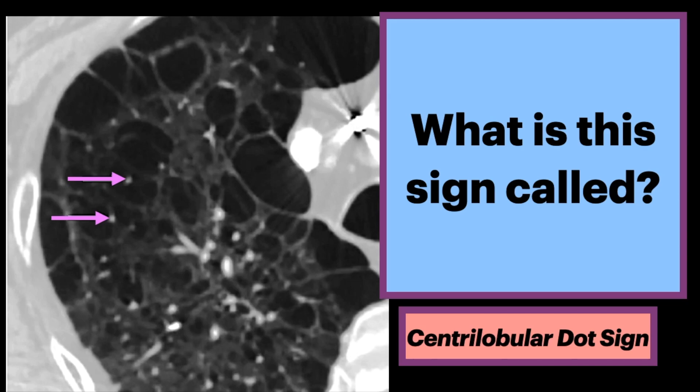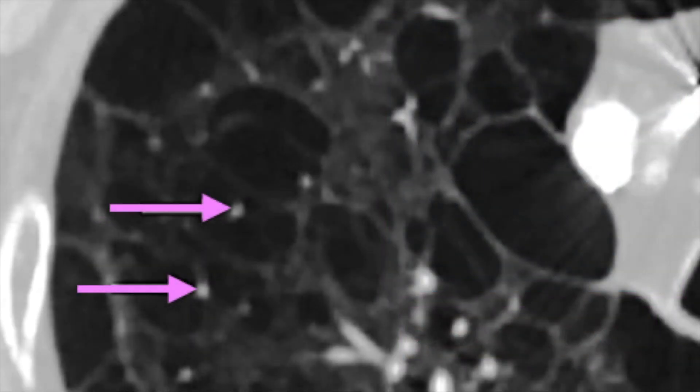What is this sign called? This axial CT shows numerous cystic areas within the lung. The arrows point to hyperdense foci in the center of each cystic area.